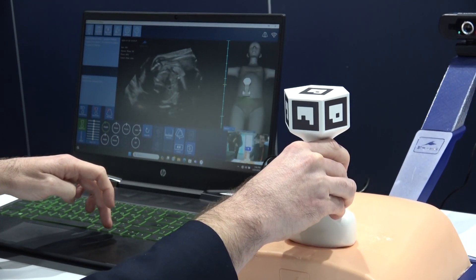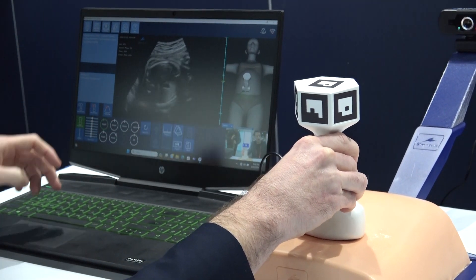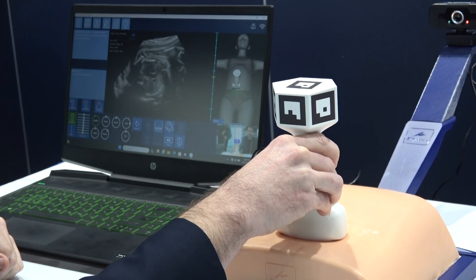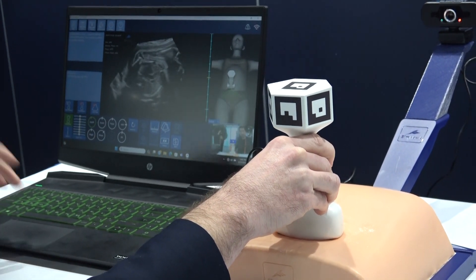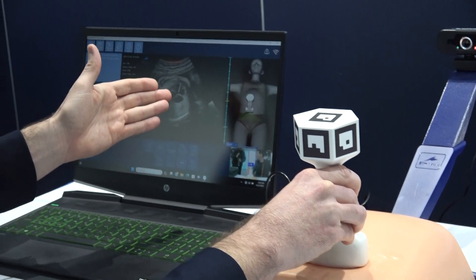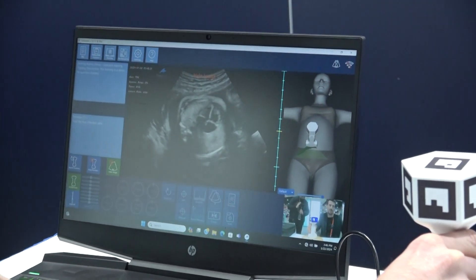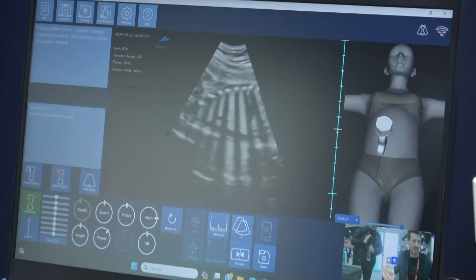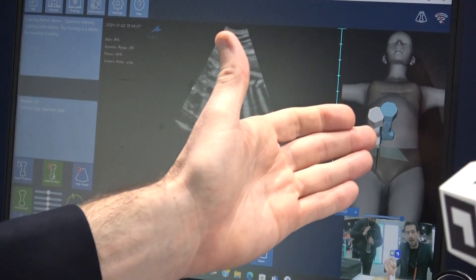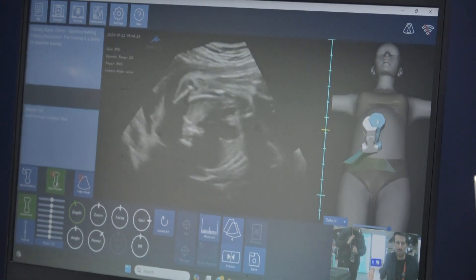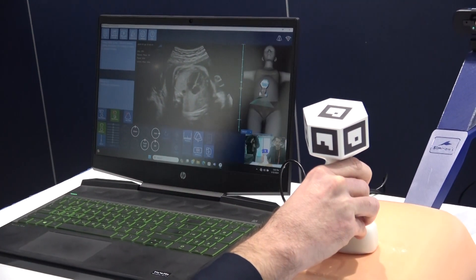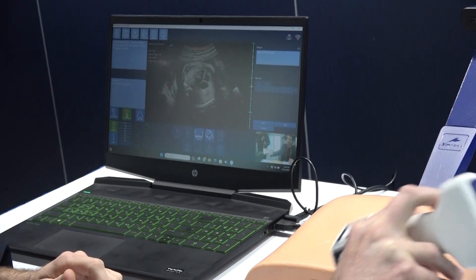What you can see here, I have a mission. The first mission is to find the four-chamber view. Let's say I'm not sure how to find it, so I have a help image. When I click the help image, it will give me the actual image I need to acquire. If I still don't know how to find it, I have a help position. If I click the help position, it's going to show me a blue probe indicating how I need to acquire the right image. And I just got the right image.